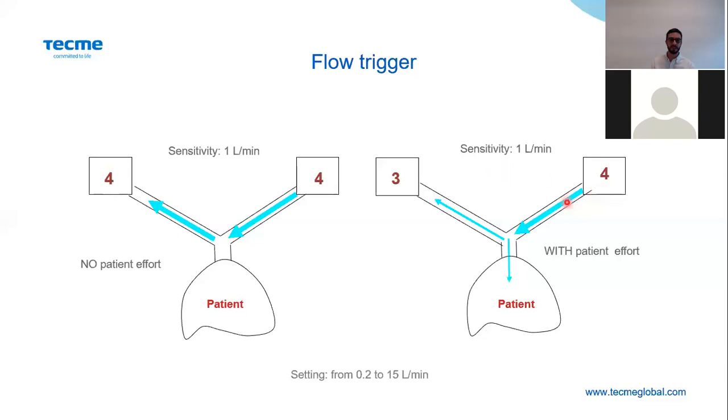It means that the patient takes 1 liter per minute, so the ventilator reads this like a patient inspiratory effort, and it will trigger an inspiration.